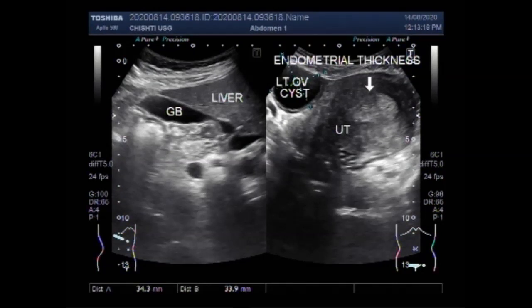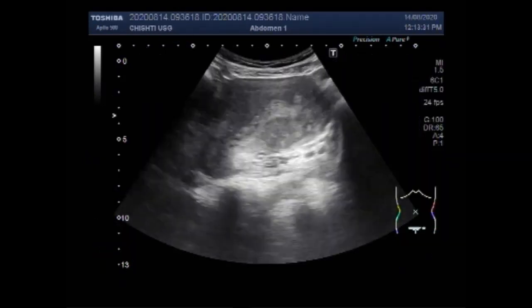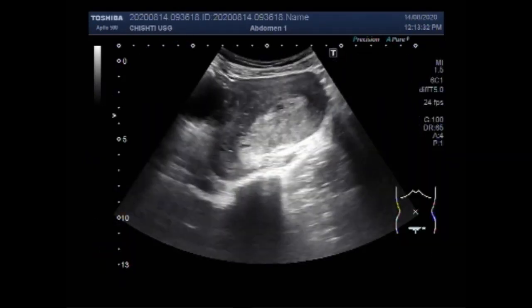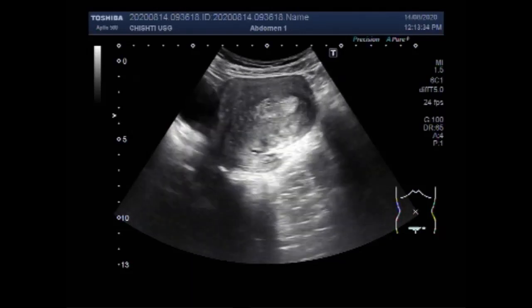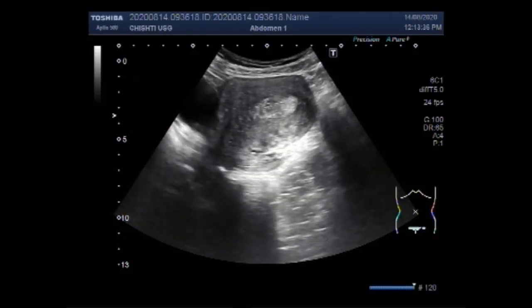This ultrasound video shows a case of endometrial hyperplasia with an ovarian cyst. You can see the uterus and the endometrial thickness is increased.